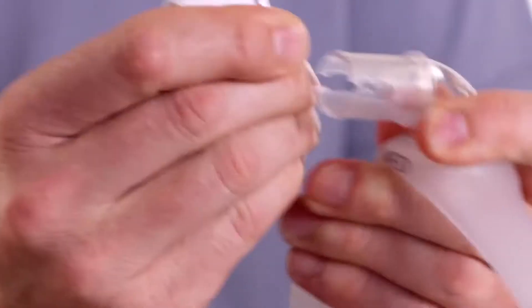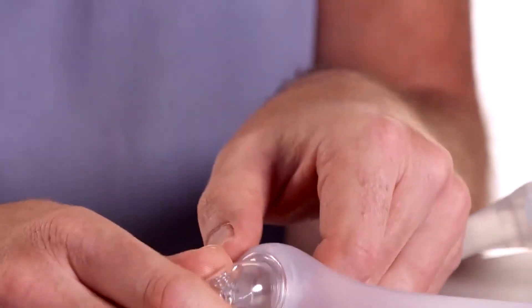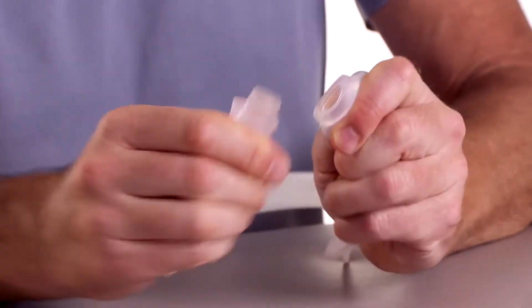Disconnect the tubing quick release from the elbow. Pull the elbow from the top of the frame. Finally, separate the cushion from the mask frame.